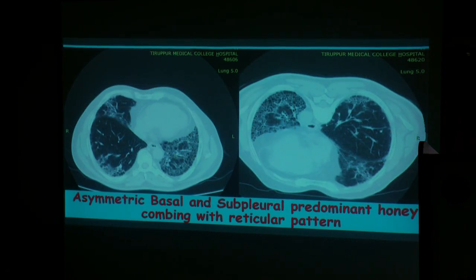the imaging in ILD is very vital. You should always acquire volumetric imaging so as to quantify the fibrosis. The quantification softwares are available. The most commonly used is Syngo's quantifying software, and prone imaging is mandatory when you suspect ILD because fine subtle reticulation and interstitial thickening are more evident in prone imaging.